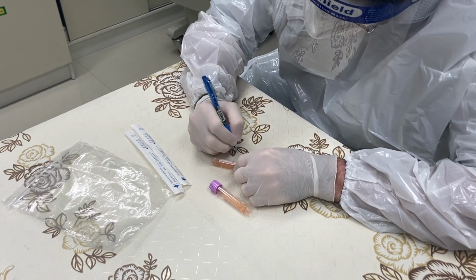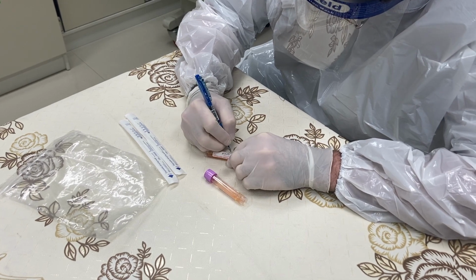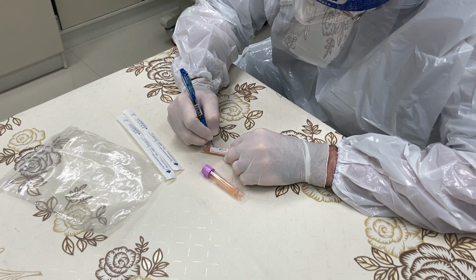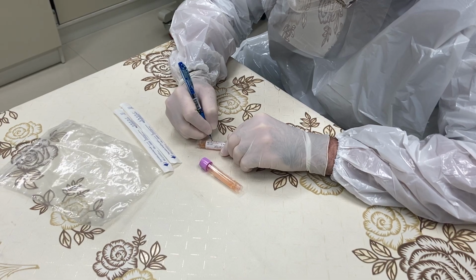Labelling the specimen tube. This information should be filled in a sticker label and stuck to the swab specimen tube or written directly on the tube in an indelible marker. It needs to be patient ID, your initials, date and time of sample collection, and type of specimen.